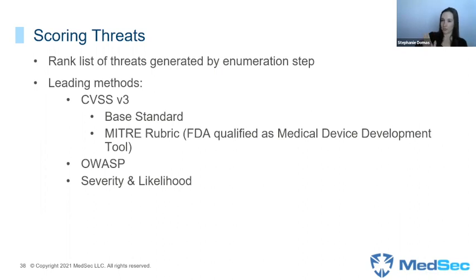I absolutely love that. It takes a lot of the weird IT stuff out of the original standard and very much translates it to the medical device space. At the end of the day, what you do get is a CVSS version 3 score, so it's nice to still speak that universal language.